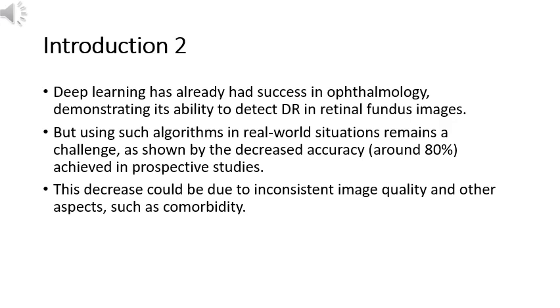Next we filter out images that do not pass our quality threshold. We then differentiate the right eye from the left eye, and finally, we proceed to the diagnosis, using the remaining images and our algorithms for AMD and suspected glaucoma.